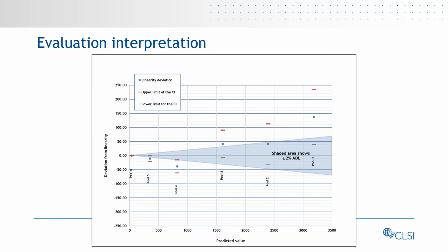The data is graphed using confidence intervals and, once again, compared to the allowable deviation from linearity.